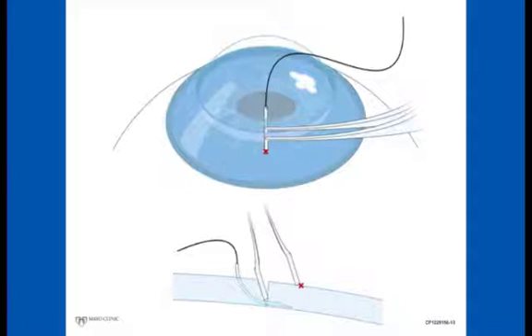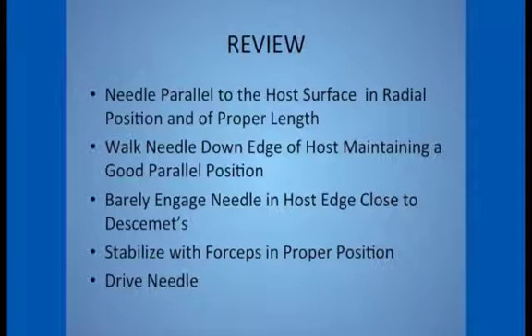Once you have done that, you can look through the cornea and confirm that you are deep and radial and confirm that the needle is engaged the proper length relative to the wound margin. If the drive is a little long, one can just slide the needle slightly back through its passage until it is the length that you wish. So let's review the steps in word form.